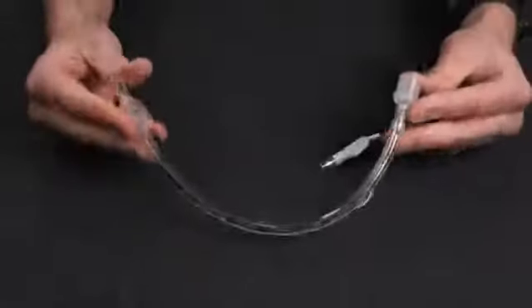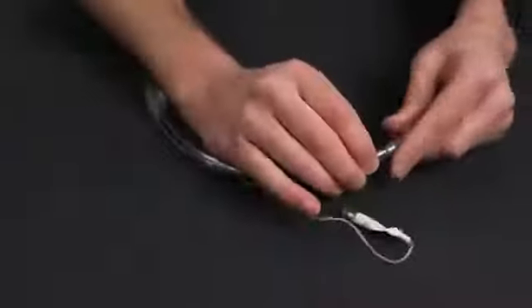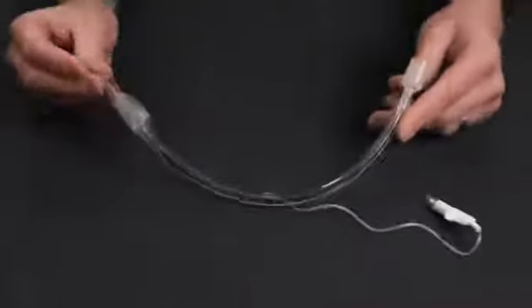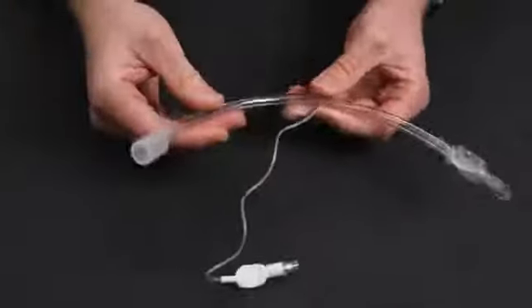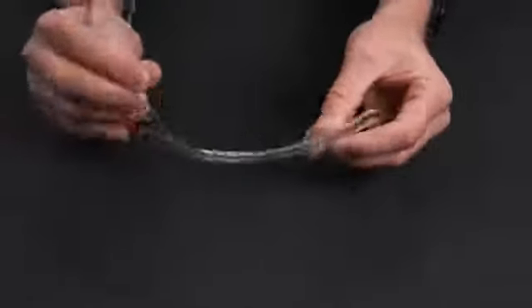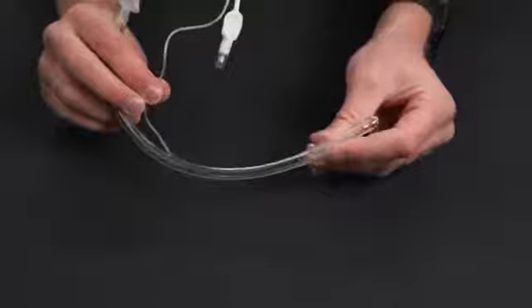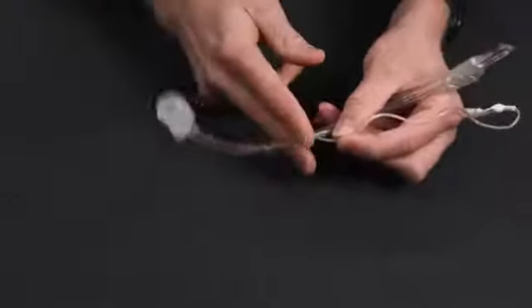The other item is if you want to cut your tube down to not have all of this hanging out in the middle of nowhere, tempting somebody to pull it out of your patient you just saved, you can cut these down. However, you have to be very specific where you cut it. You have this tube that comes out, that is the inflation lumen for this balloon down here that actually protects the airway and allows you to provide positive pressure. So when we're doing this, we want to make sure we cut right above it.